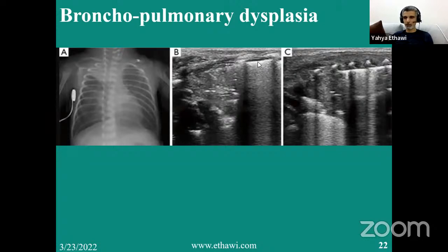You can see that there is a pleura, but it's hard to differentiate from the B lines. There is a little bit of pleural effusion. And again, you can see, although there is pathology, the B lines still go. So it's like not pneumonia. In some areas you can see the pleura, in other areas you don't. You can see the B lines are starting in different planes. And sometimes you can see A lines, but mostly you'll see fluid and air bronchogram.